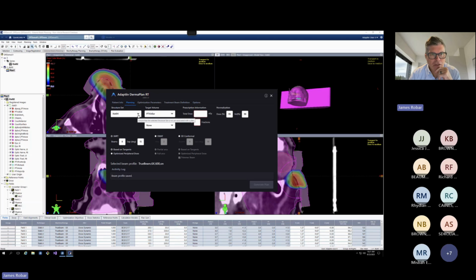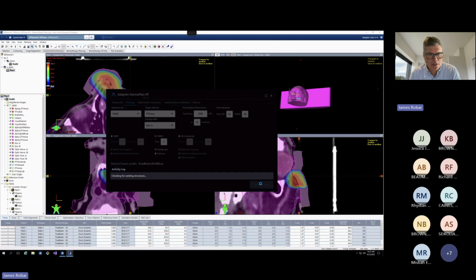So let's go back to create another plan. I'll use the Xeil 02 set here just for comparison. Let's do the nose again, protect the left eye. The dose here is kind of inconsequential to us, but let's do a 2 arc VMAT plan with partial arcs, and we will set that into motion. So that'll take a few minutes, and so instead of just leaving you with total silence, I'll stop sharing that, and we'll jump back to presentation here.